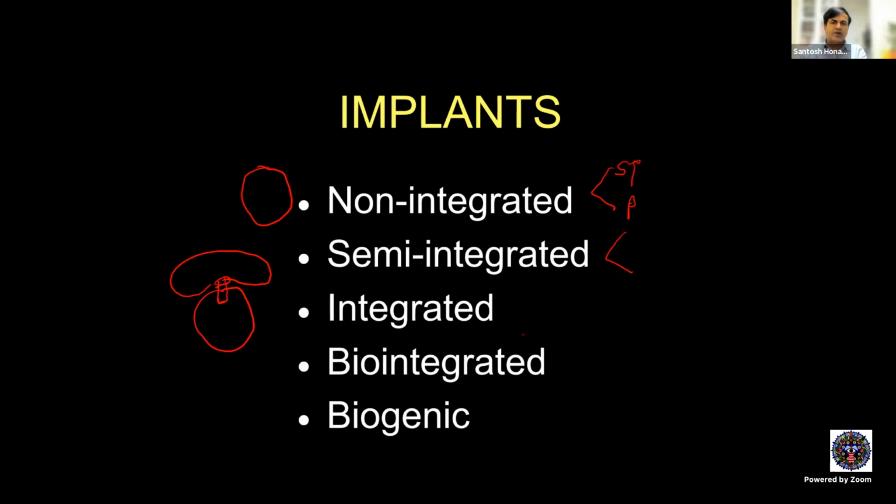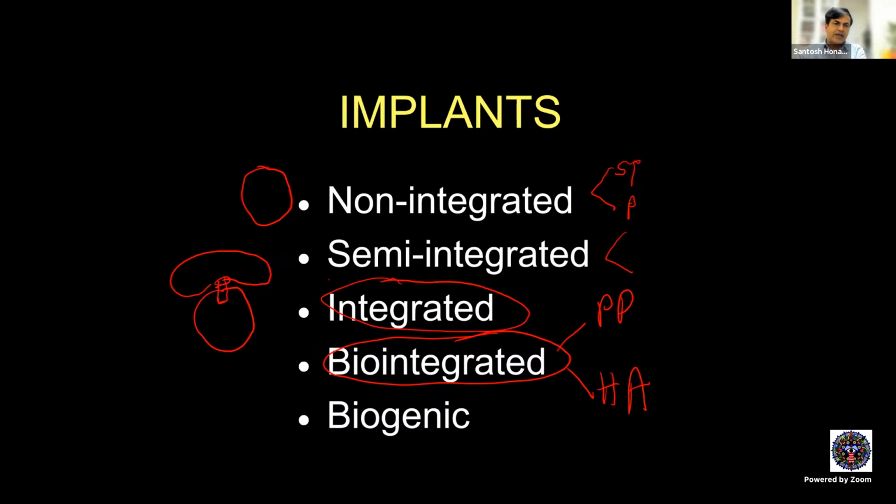Now, bio-integrated is definitely either porous polyethylene or hydroxyapatite. That means there is biological integration. So this integration is mechanical, whereas this integration is biological.